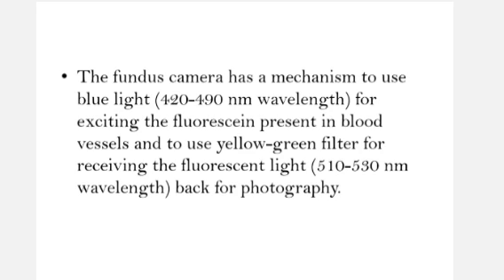The fundus camera has a mechanism to use blue light. It works on blue light of 420 to 490 nanometer wavelength for exciting the fluorescein present in the blood vessels, and uses a yellow-green filter for receiving the fluorescent light, for the photography.